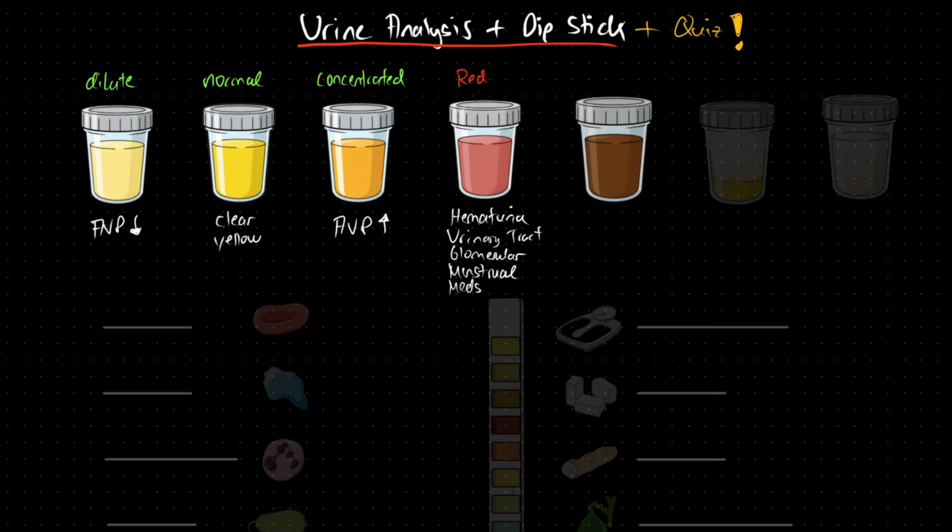Next, brown urine has two major causes. The first is myoglobin, which is released during rhabdomyolysis, which is the breakdown of skeletal muscle tissue. The second cause is cholestasis, which means the bile can no longer flow properly from the liver into the intestine. The bile consists of bilirubin, and bilirubin then accumulates in the blood and is excreted in the urine, causing the urine to become dark brown.